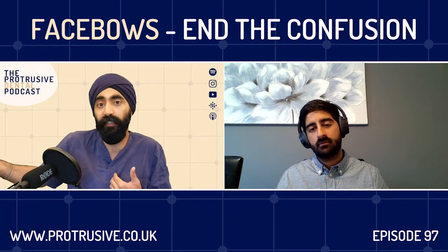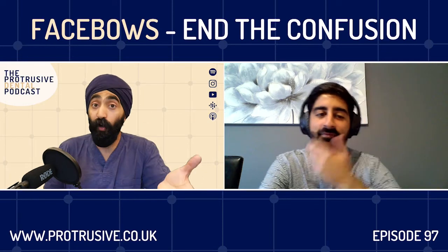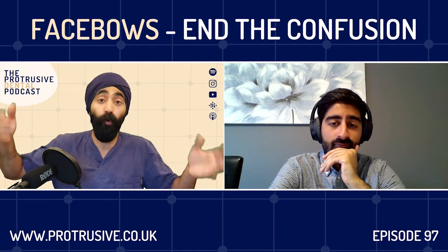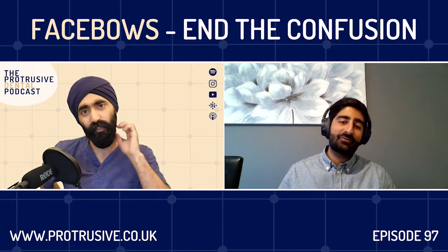So what are you sacrificing? You're sacrificing some information, so the lab is now going to be using average values, which may or may not correlate to your patient. And then you may or may not then be doing a lot more adjustment. Supposedly, we need studies to show that, okay, with an articulator, with a Facebow and without a Facebow, how many more minutes of adjustment are you doing? That's what we kind of need to decide that, okay, if you're only doing an extra 2 minutes, are there any studies showing it with respect to Michigan splints?